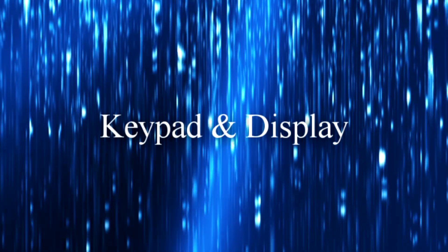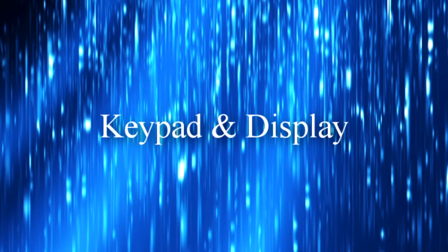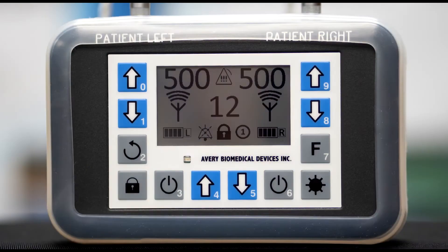Keypad and display. The keypad contains 12 keys. Keys that are enabled generate a notifier sound to alert that the key press was acknowledged. The notifier sound is a short beat played from an internal speaker. The visual alarms have an LED indicator on the keypad overlay below the display.